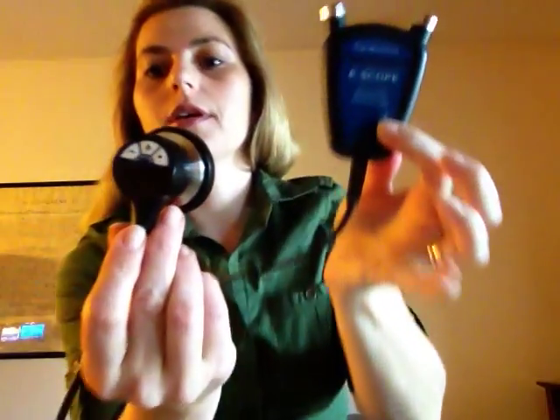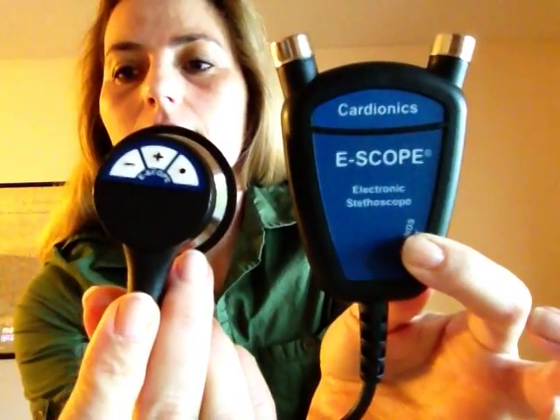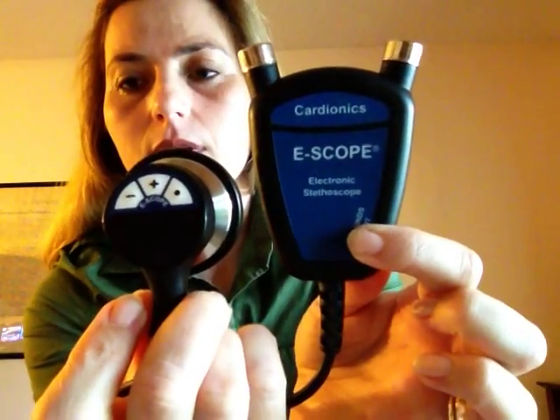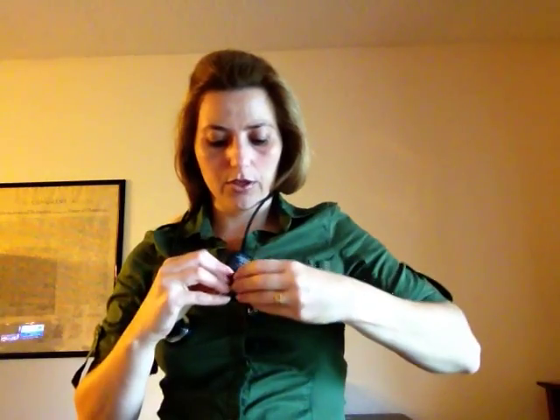This second one is the e-scope from Cardionics. Let me show you — it's quite similar to the Littmann, the functions are the same. You can use it like the other one, and it has this little piece here that clips onto your belt, which makes it very nice to carry.